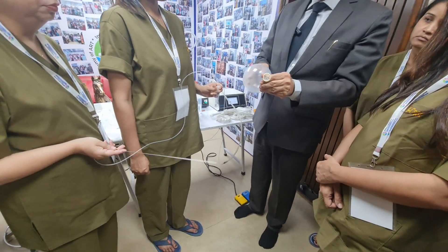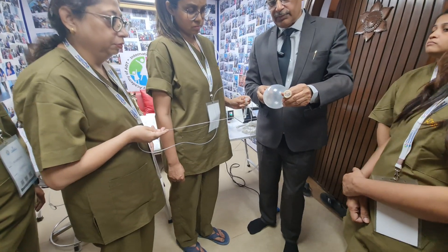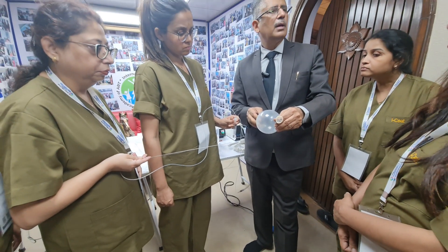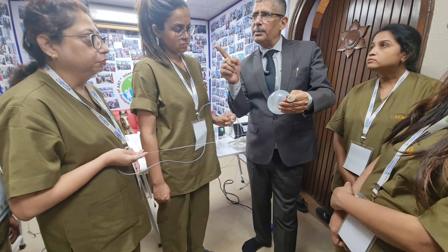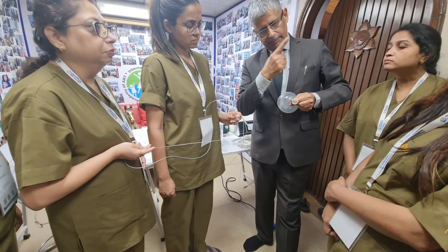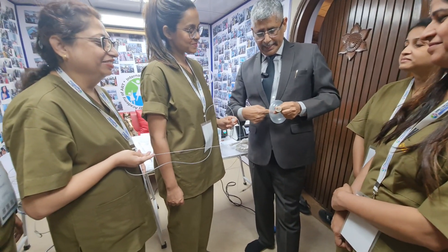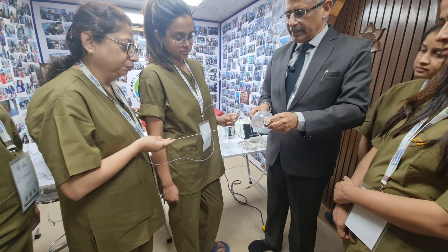Madam is going to do the puncture now. Just keep a watch — if you touch it, it will burst. Always remember: 90 degrees is important. She's back with us — 90 degrees, never tension. Now let's see what happens.